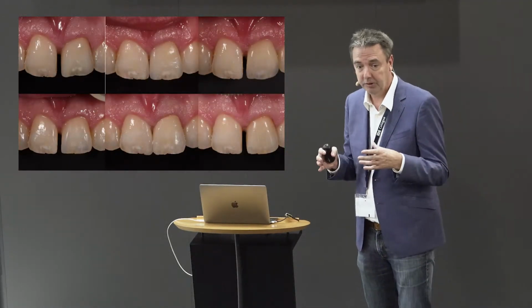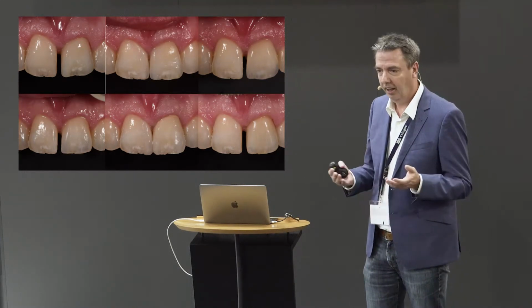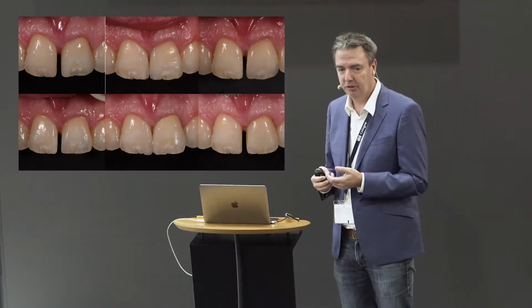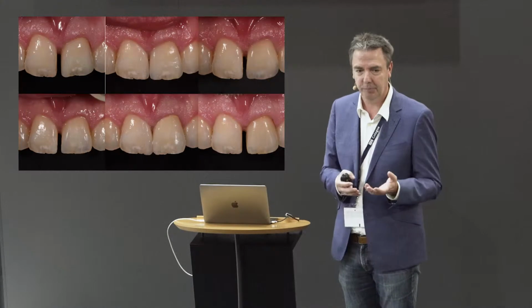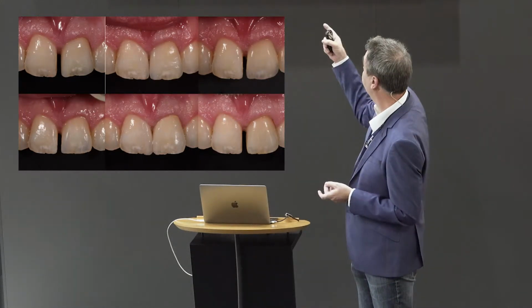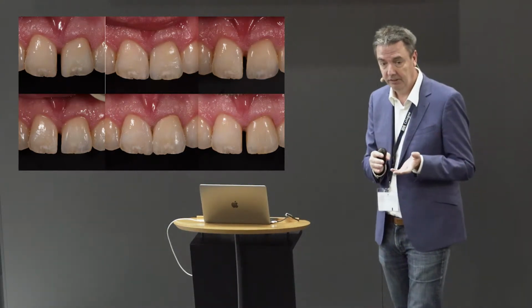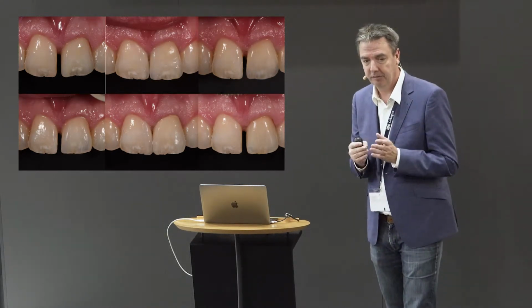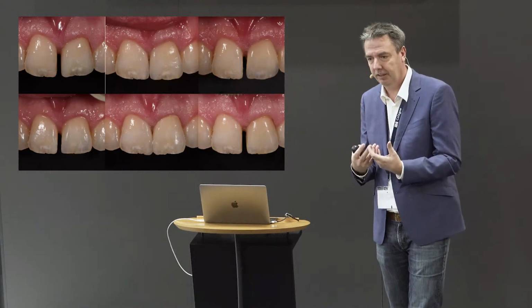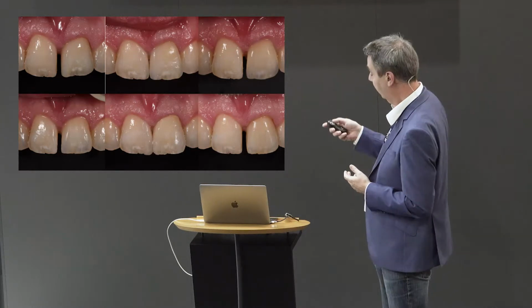And finally, this was a live patient course, so we have 6 more results. The patient and I were totally unable to decide which is the best crown, which is the best case to cement. So we have 2 restorations, not only with a crown, also with a partial veneer. And at the end, the patient decided to keep the gap because he said, that's me, that's my personality, I don't want to close the gap, but I would love to get the crown which really fits perfect.